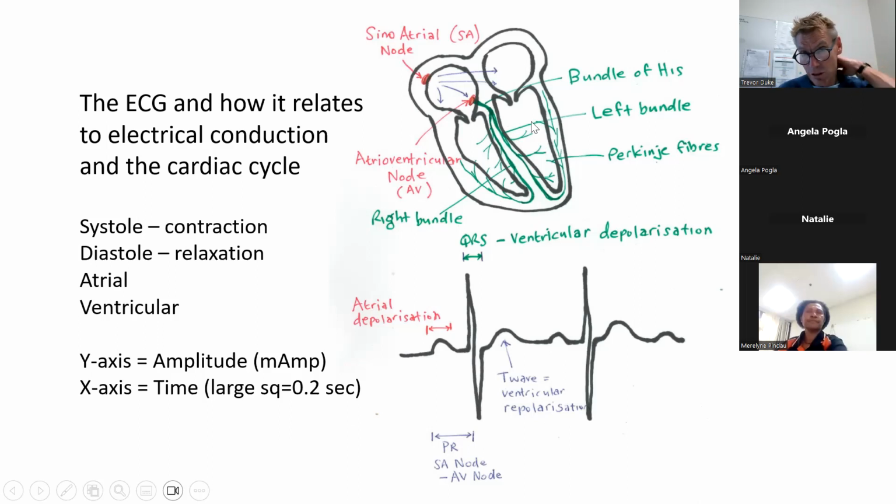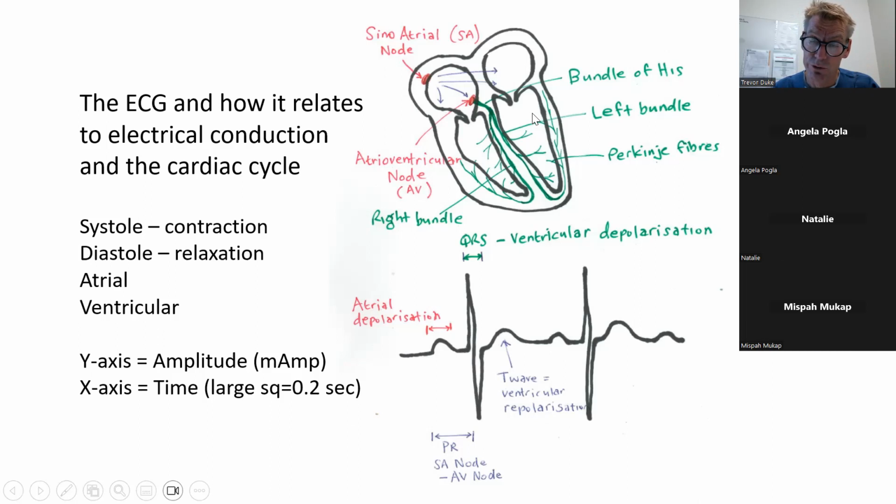Whereas if a child's got ventricular tachycardia, then it starts somewhere besides the AV node. There's some pacemaker cells or some scarring or something that's stimulating an electrical impulse in the ventricle, and it goes around a slow route around the ventricle.